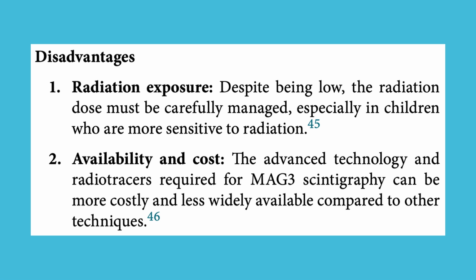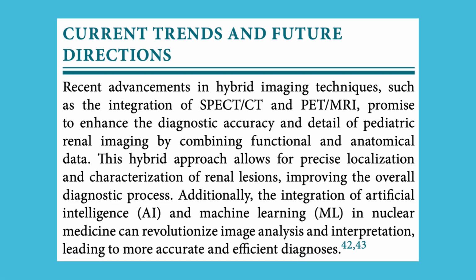The advanced technology and radiotracers required for MAG3 scintigraphy can be more costly and less widely available compared to other techniques. Current trends and future directions. Recent advancements in hybrid imaging techniques, such as the integration of SPECT/CT and PET/MRI, promise to enhance the diagnostic accuracy and detail of pediatric renal imaging by combining functional and anatomical data. This hybrid approach allows for precise localization and characterization of renal lesions, improving the overall diagnostic process.